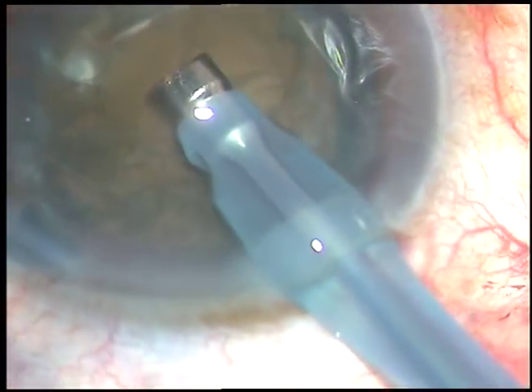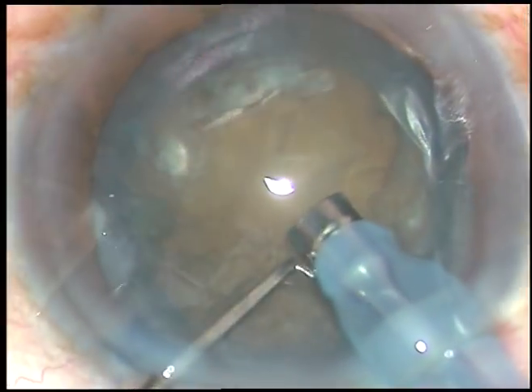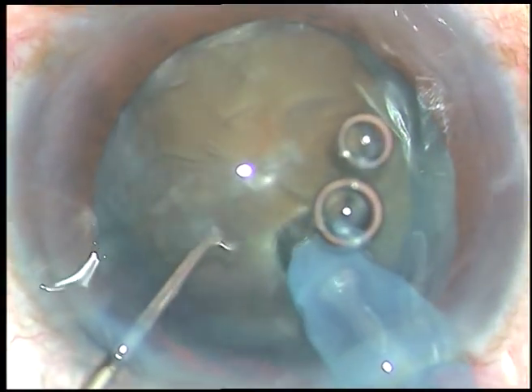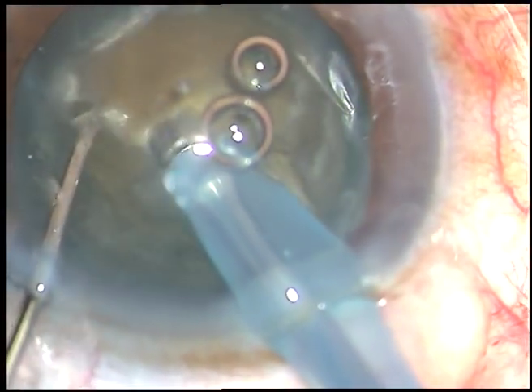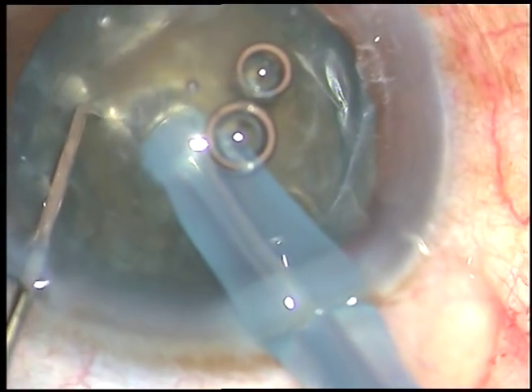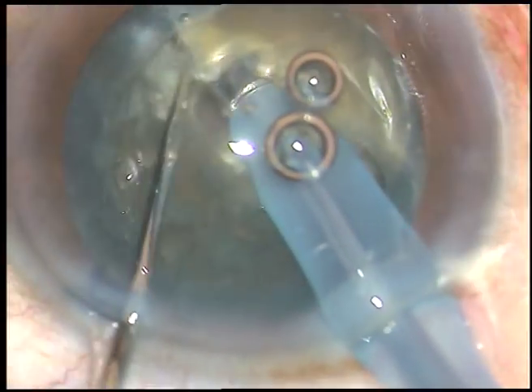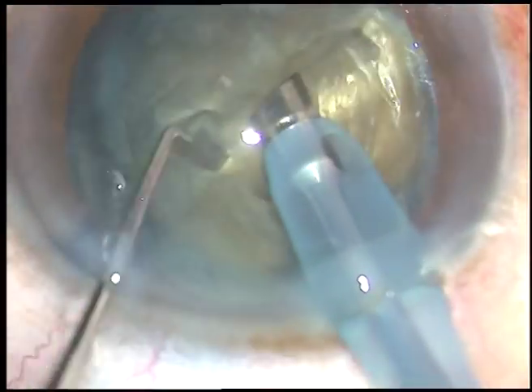This is submarine chop. Push the nucleus down. Enter into the substance of the nucleus. Go through the nucleus just like a submarine travels through water. And as you cross the center and reach near the opposite equator, you chop it. See how easily you can chop the nucleus at one go.